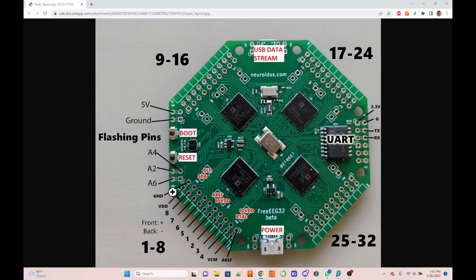Where to find the pins, and again, if you want to make a linked ears type of connection, then you usually take all of the negative pins of the channels and interconnect them, and then using two ear clips, one to the left ear, one to the right ear, you would have a linked ear setup. And then all the other channels, however many you use, go to the different positions. The plus terminals go to a position on the head, you know, the 10-20 system, or whatever you do.